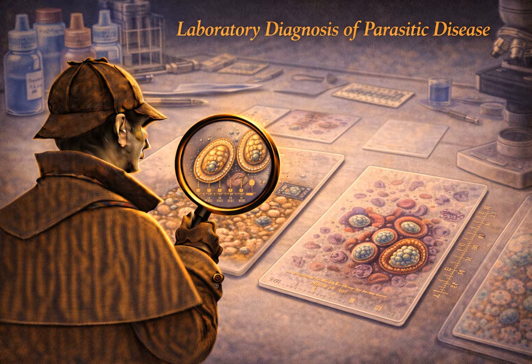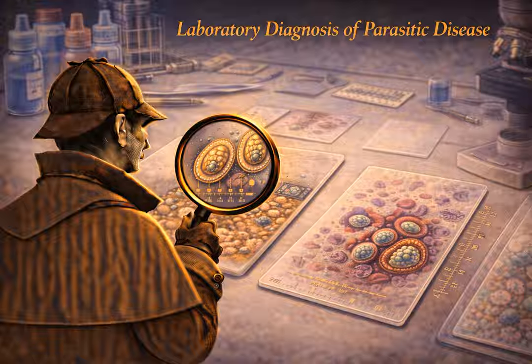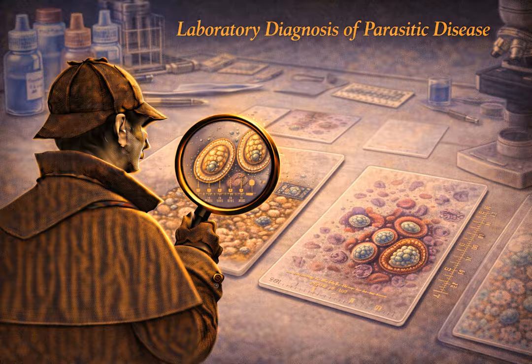The adult female inside that nodule continuously releases millions of tiny microfilariae. These don't go into the blood. They migrate directly through the dermis, the upper layers of the skin, causing incredibly intense, maddening itching. The clinician takes a tiny superficial slice of skin, trying to make it completely bloodless if possible, just epidermis and upper dermis, puts it in a drop of warm saline on a glass slide, and waits.